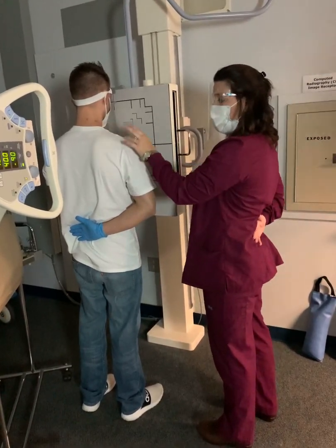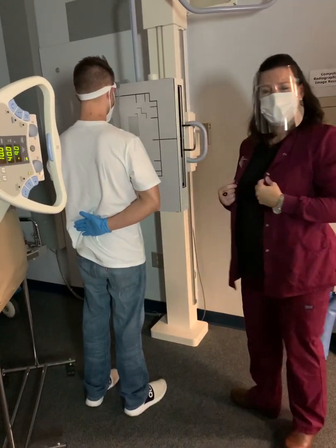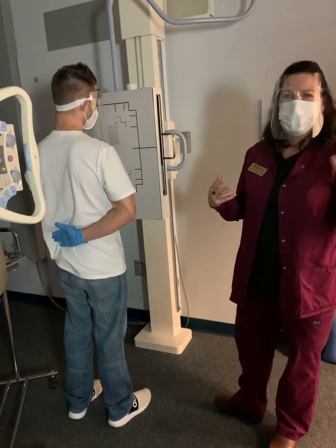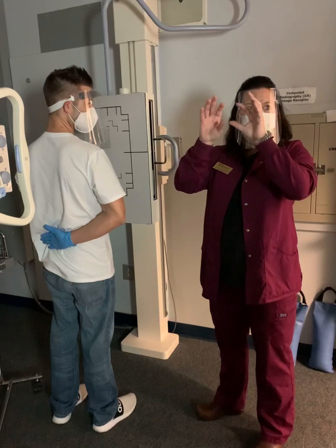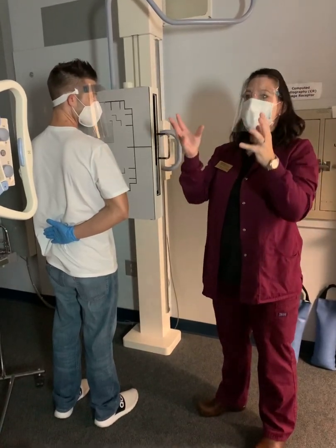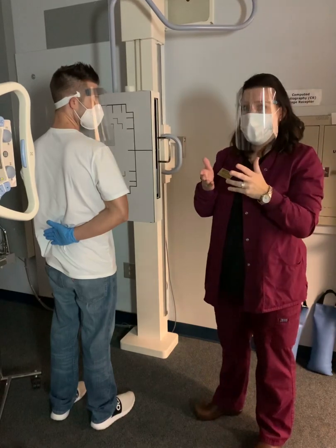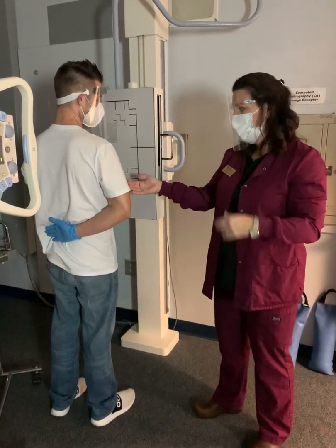Doing this shows you the acromion and the coracoid. Your book says, what's the word they use? Delineation of the coracoid and the acromion. Delineation just really means you're seeing the outline, the borders of it, and you're seeing it as you should be able to see it, pretty accurately. So doing this method will show that to you.